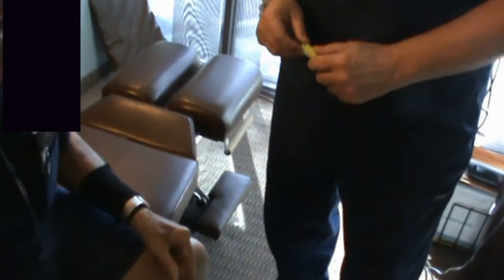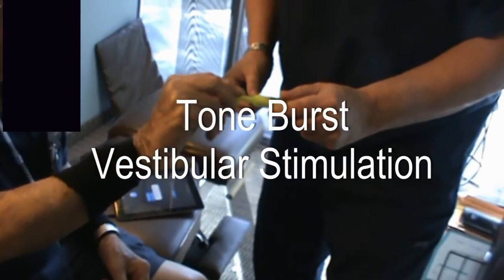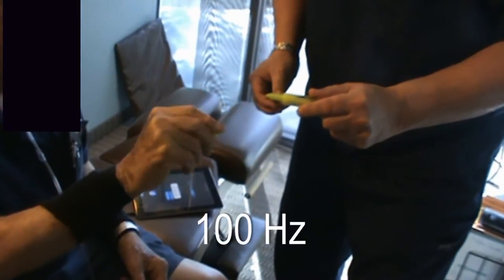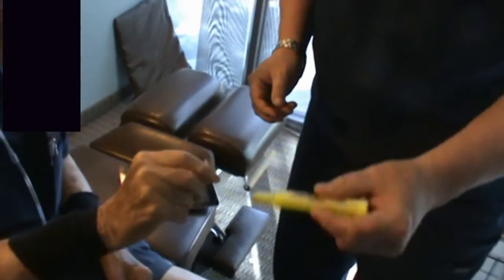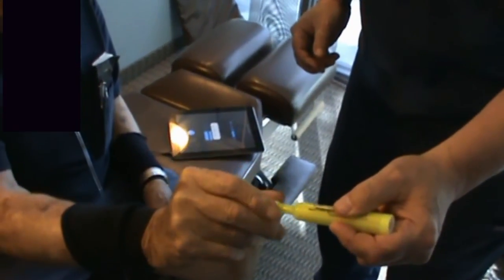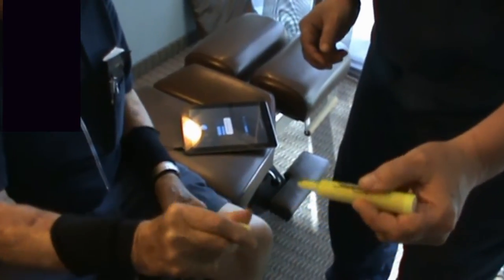Okay. Now I'm going to play some tones in your ear, and I want to see if that helps you. So you can stop. Take it off, put it on. Take it off, put it on. Okay, try it with the other hand.